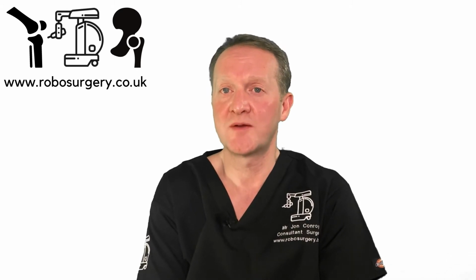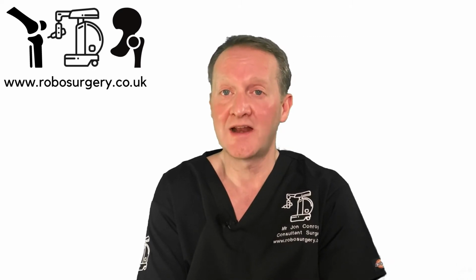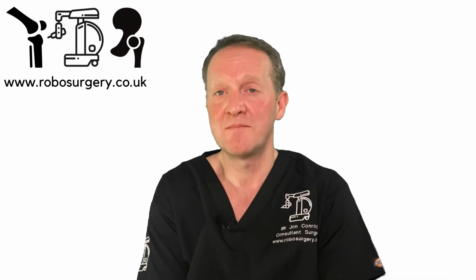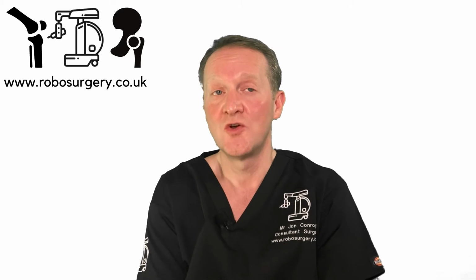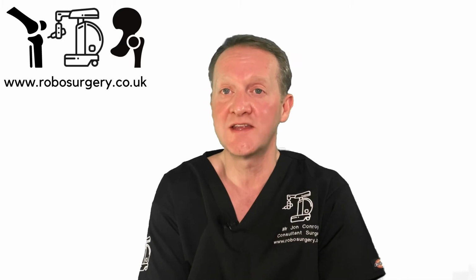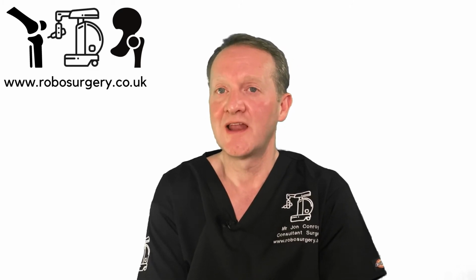In terms of leg length discrepancy, this can be quite a debilitating complication after a hip replacement. The Mako system gives us real-time position of the hip and the leg length. We are therefore able to monitor the leg length during the procedure, and before we finish the procedure, we can accurately measure this, and if any alterations have to be made in the leg length, it can be done prior to the end of surgery, ensuring the patient has the correct leg length at the end of the procedure. It also has the ability for us to lengthen the leg slightly or shorten the leg slightly.